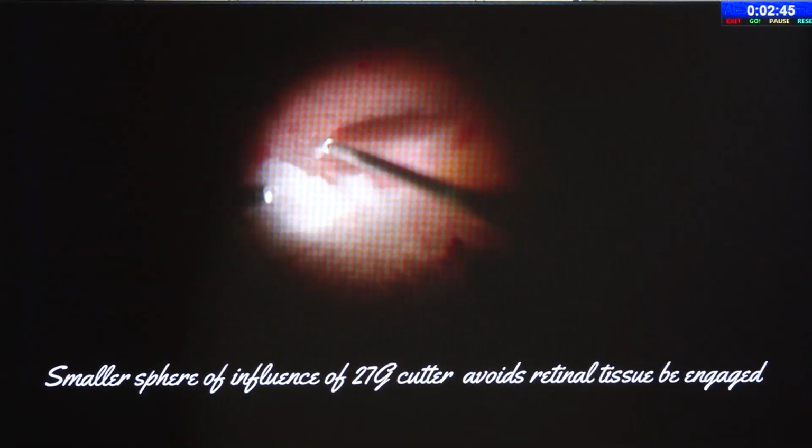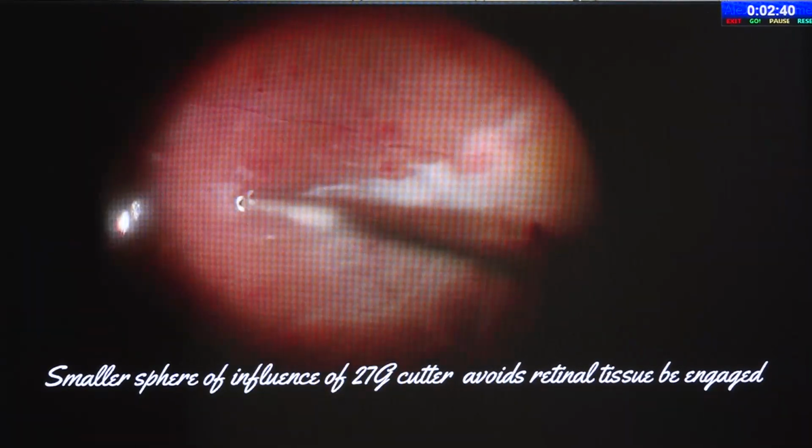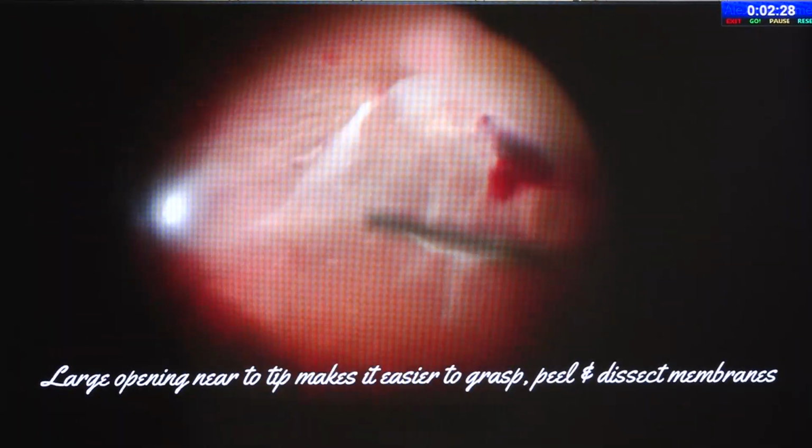Now this peripheral vitreous acts as a second hand. It just keeps your membrane taut, acts like a second hand. What you want to achieve in a bimanual vitrectomy, you can just achieve by having this vitreous over there. And then you just go in and keep on dissecting this membrane easily. And the small gauge vitrectomy also helps because it keeps the retina very stable while you are doing this dissection.